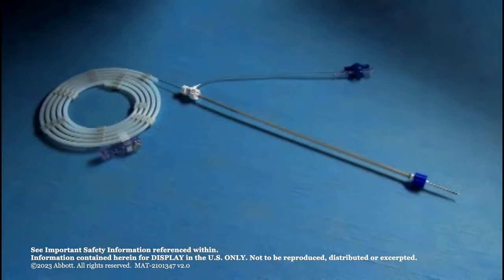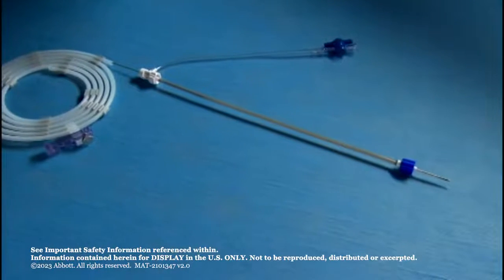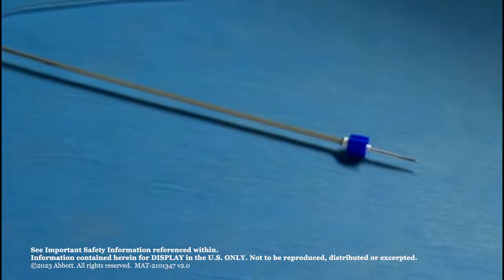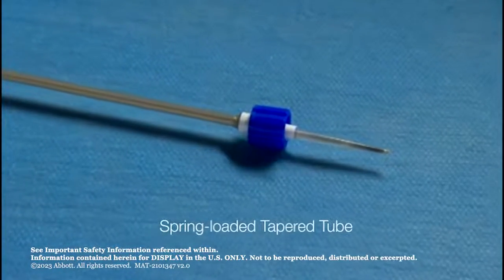The AVP-4 is shipped attached to a 155 cm delivery wire in a hoop dispenser. The device is preloaded in a loader. A plastic vise is also included and may be attached to the delivery wire to facilitate device detachment. The tip of the loader is a spring-loaded tapered tube that engages the diagnostic catheter and cannot be detached from the loader assembly.